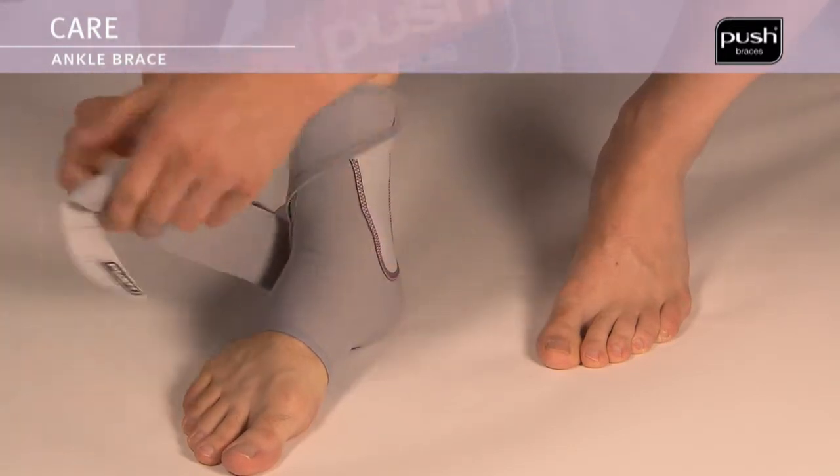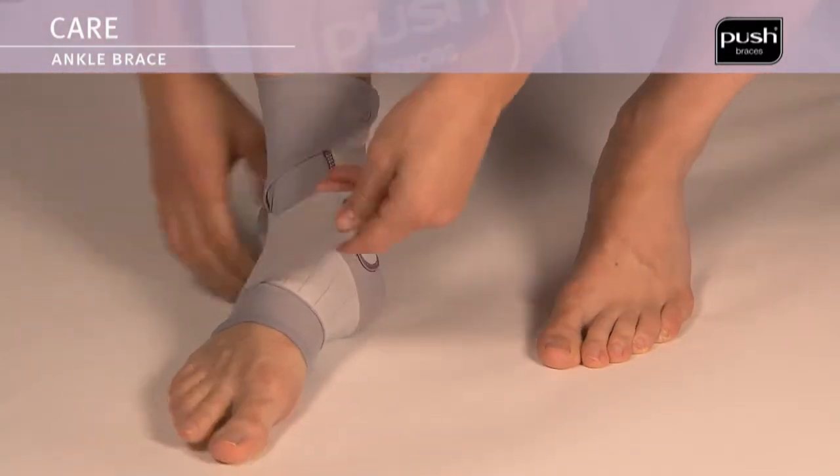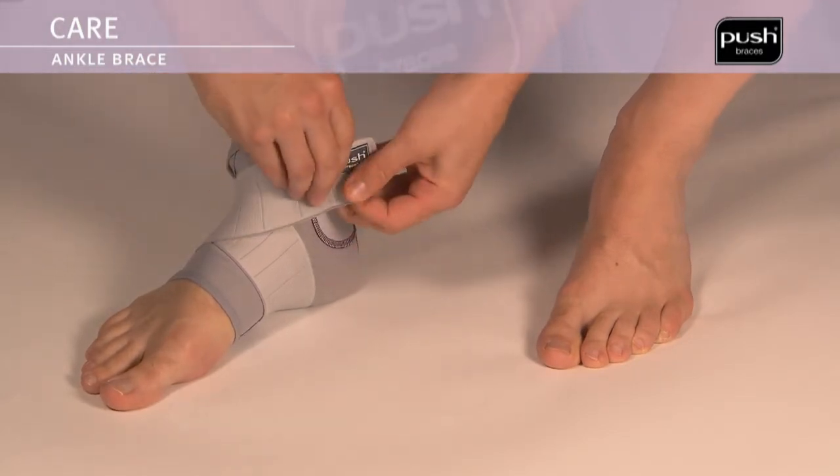Wrap the long elastic band around the front part of the foot. Close the long elastic band on the inside of the foot over the short elastic band just above the ankle bone.